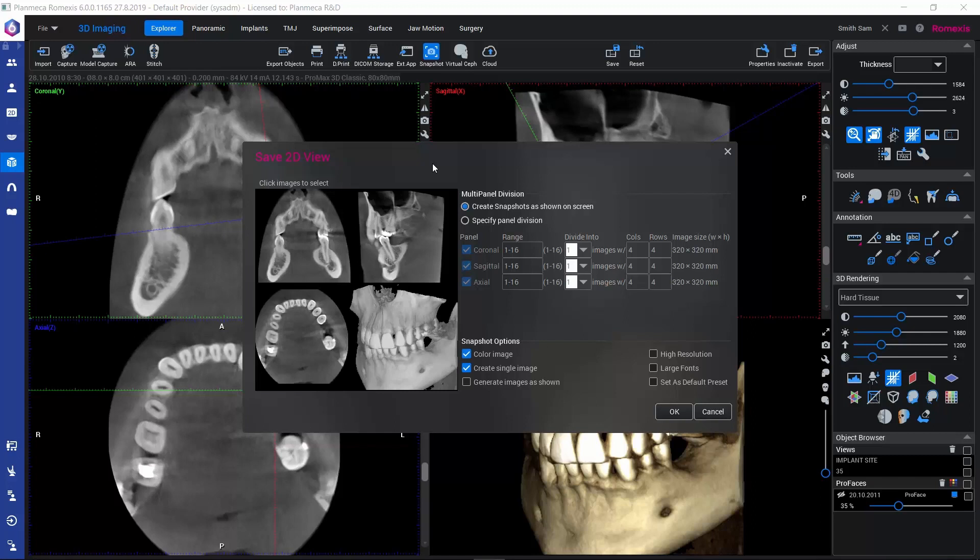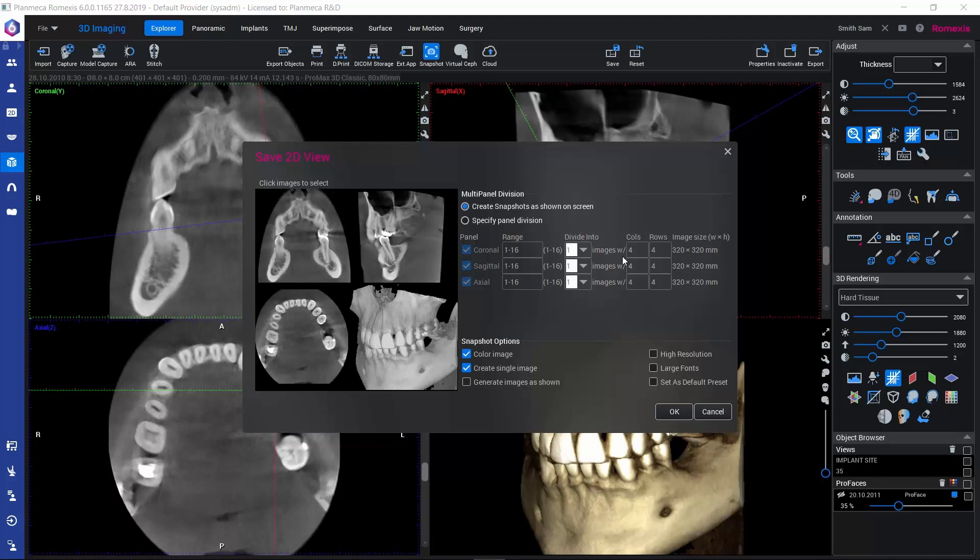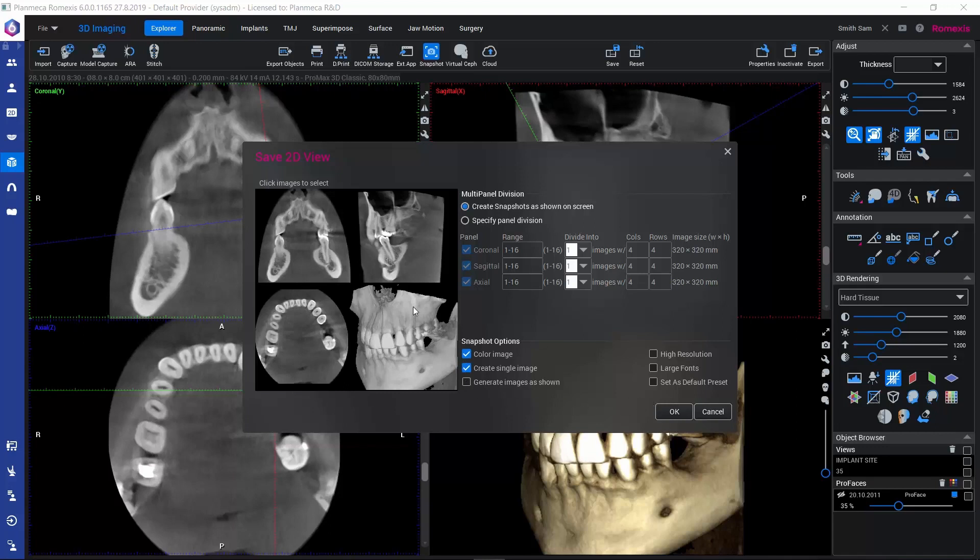First, if we would like to save several slices of the views and configure the layout in which they would appear as 2D images, we can use this multi-panel division here and specify how many slices and how they would be distributed in columns and rows. If we would just like to simply save some of these four views here, we can play with the options here.